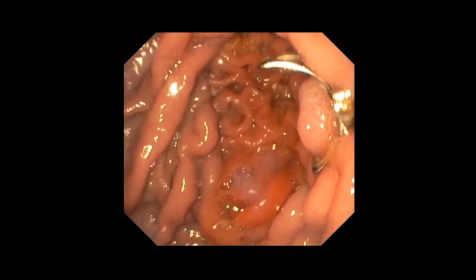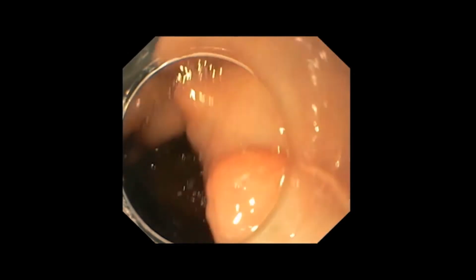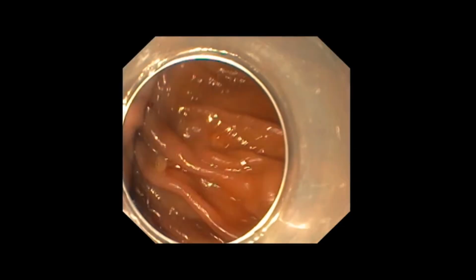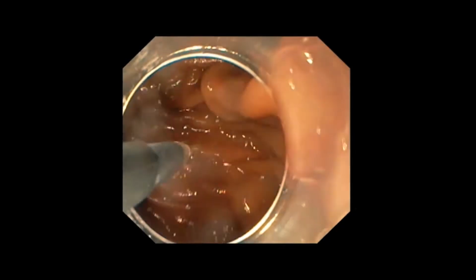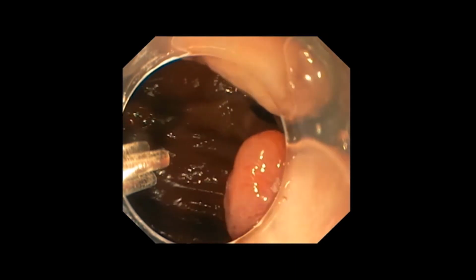In this patient, recurrent bleeding from vascular anomalies in the area of a gastrojejunal anastomosis had developed. The Ovesco clip is in situ, but only one third of it is still attached to the tissue. A bleeding source at the base of the clip is suspected. The aim is therefore to remove the clip to allow further endoscopic therapy.